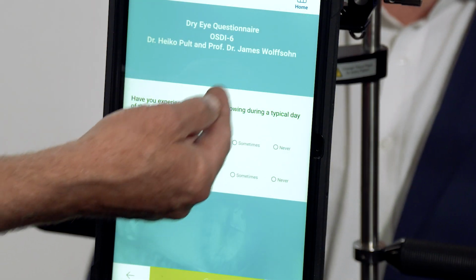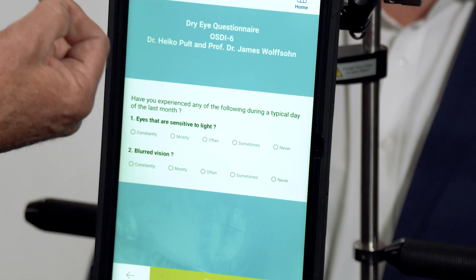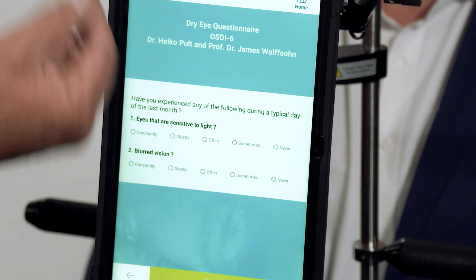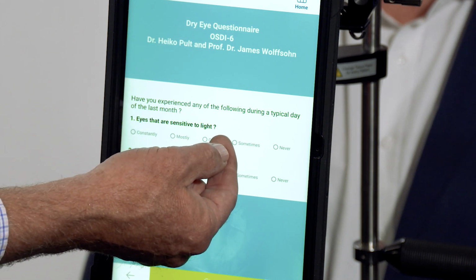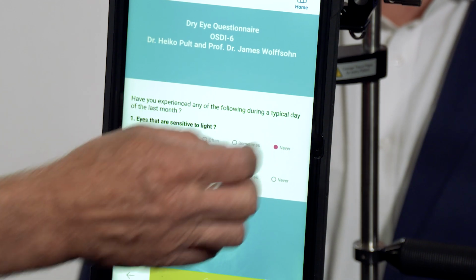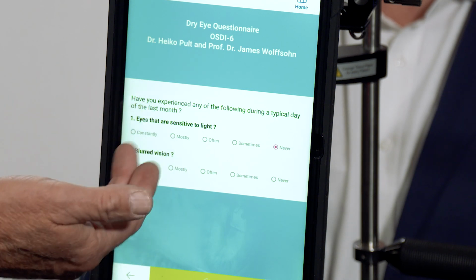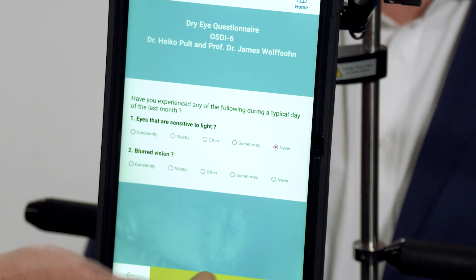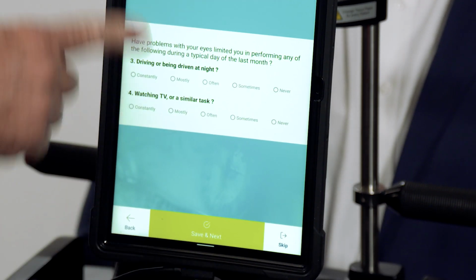Josh, have you experienced any of the following in a typical day during the last month? And the question is, eye sensitive to light, and your answers would be constantly, mostly, often, sometimes, or never. Never. Never is his answer. Blurred vision. Any sensitivity there? Constantly, mostly, often, sometimes, or never? Sometimes. So we'll mark that and we'll hit save and next.